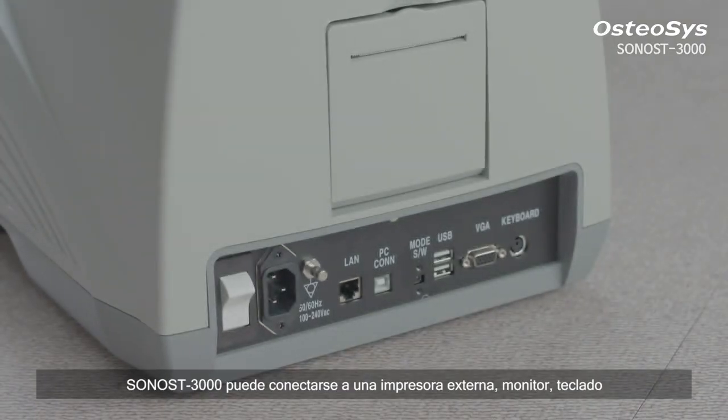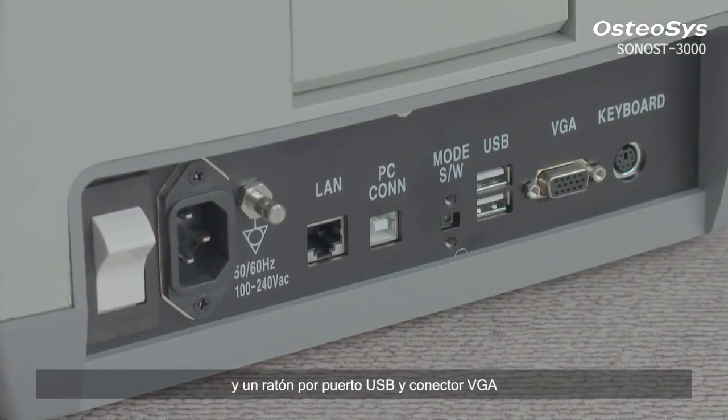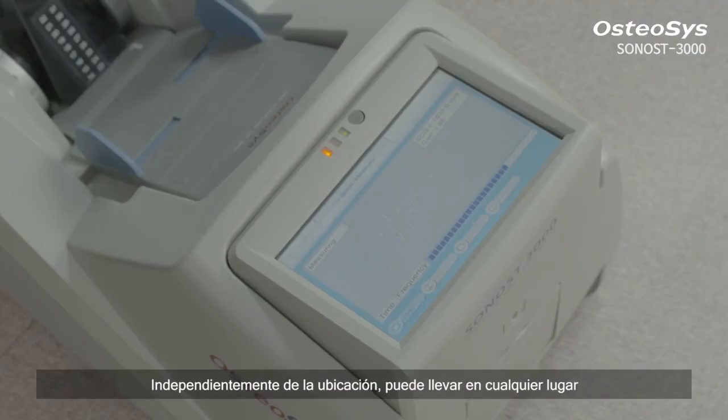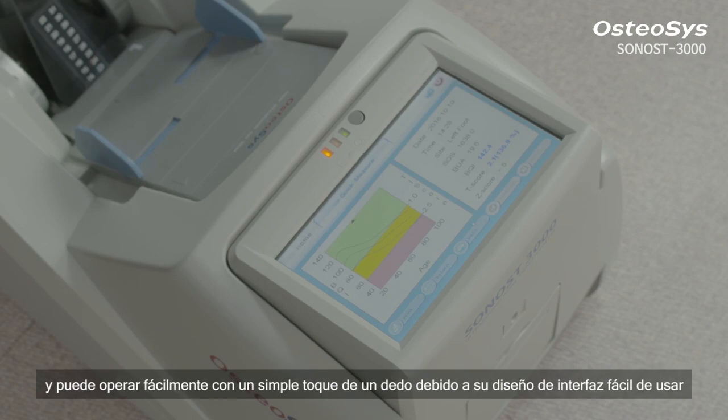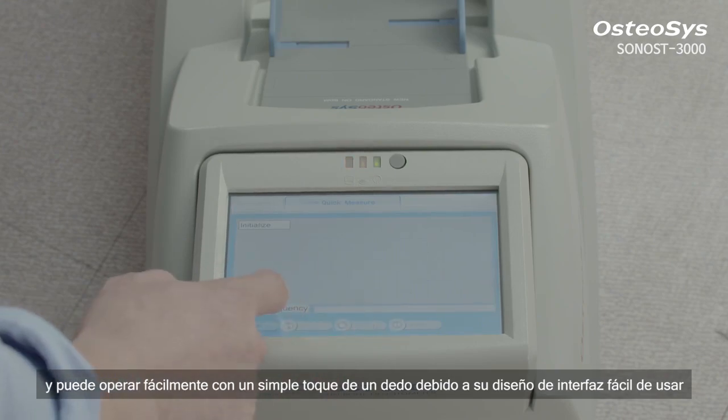Sonos 3000 can be connected to an external printer, monitor, keyboard, and a mouse by USB port and VGA connector. Regardless of the location, you can carry it anywhere for your measurement, and you can operate it easily with a simple touch of a finger, due to its user-friendly interface design.